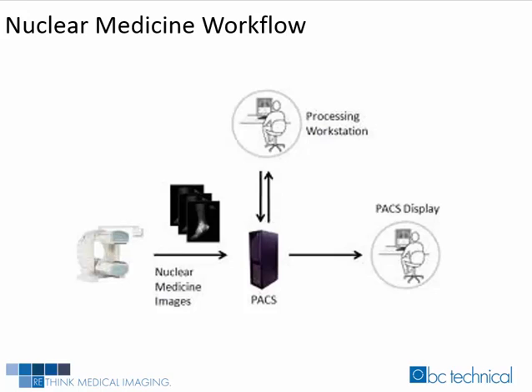The typical nuclear medicine workflow starts with a patient registering and the demographic information sent to the modality work list through an HIS-RIS, which is a hospital information system, or a radiology information system. Once the patient's exam information is available, the nuclear medicine acquisition computer registers the patient's demographic information and begins the scan.